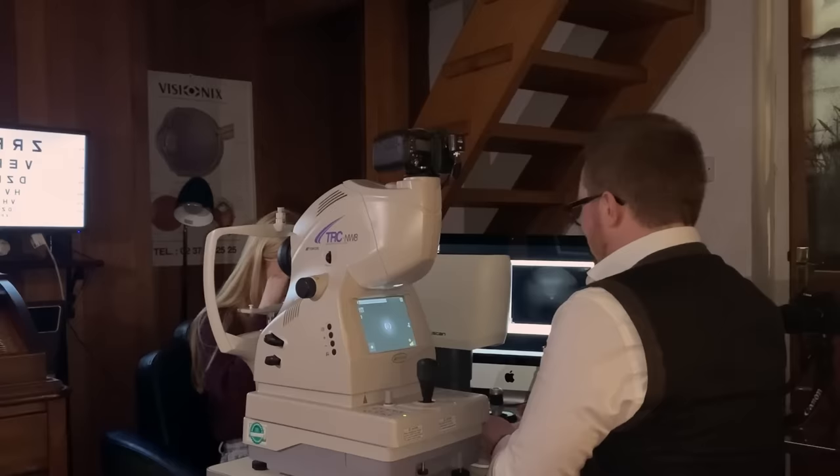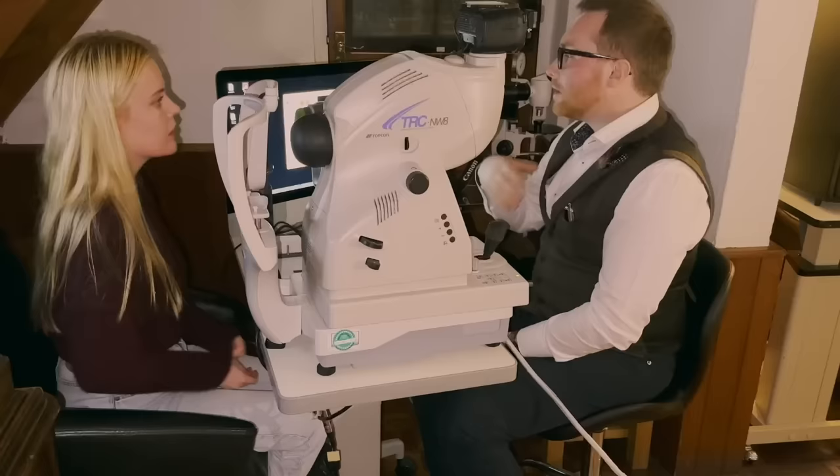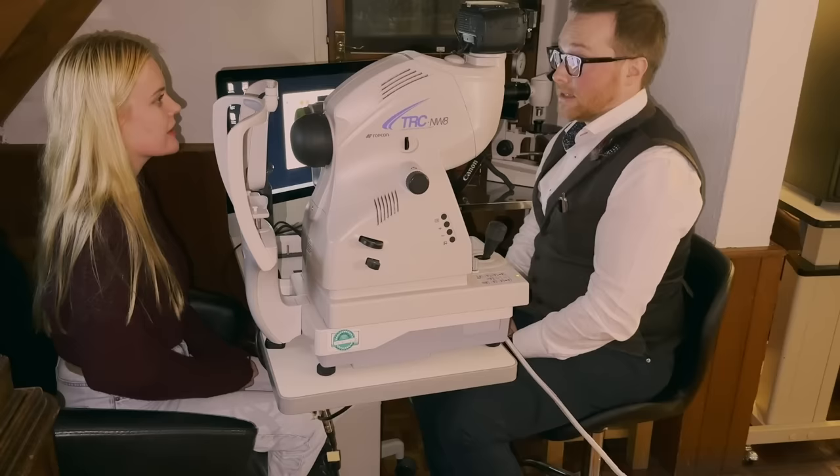So, we can have a look at those images. Essentially what this one has done is it uses laser light to look at the layer underneath this one, the directly observable retina. So it gives us an idea if there's anything under the surface that's going on, a little bit like the 3D scans it might have had previously.